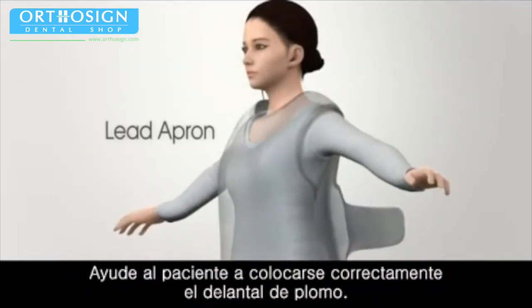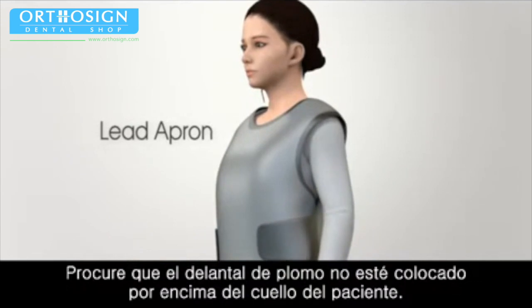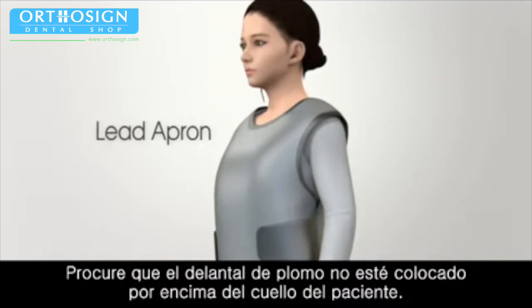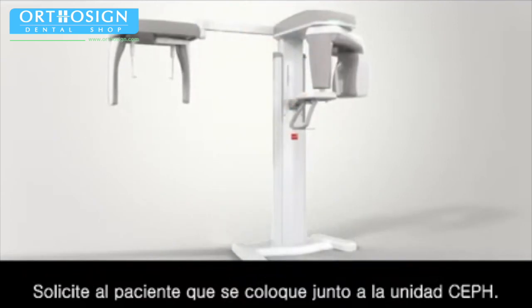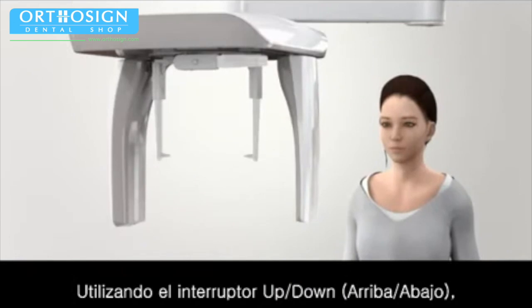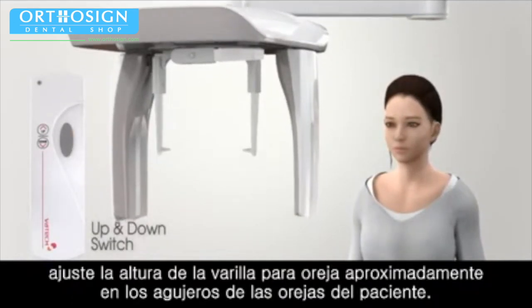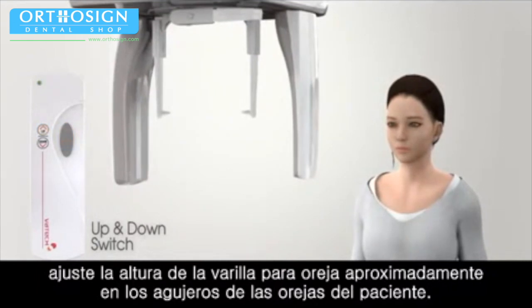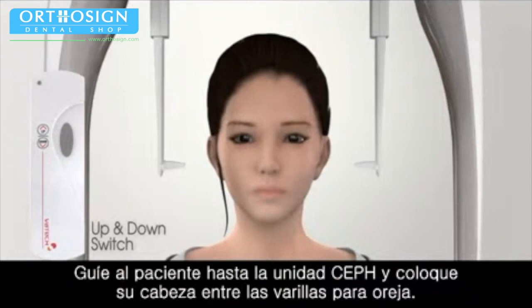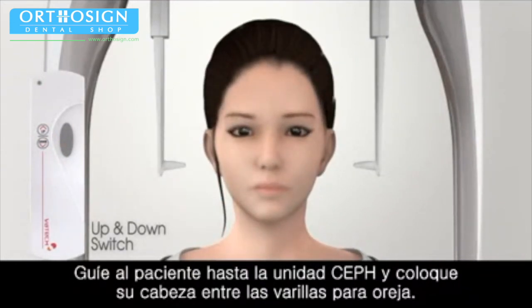Patient can keep their removed jewelry personally or place them on the guided shelf. Assist the patient to appropriately wear the lead apron. Be careful the lead apron is not above the patient's neck. Ask the patient to stand next to the Ceph unit. Using the up-down switch, adjust the height of the ear rod at the patient's ear holes approximately.